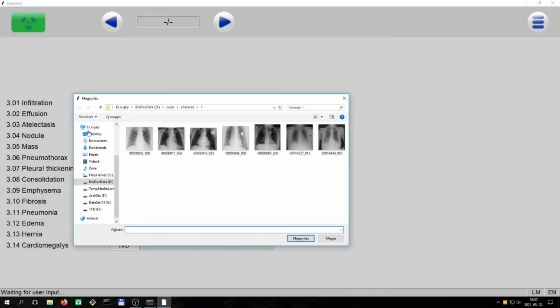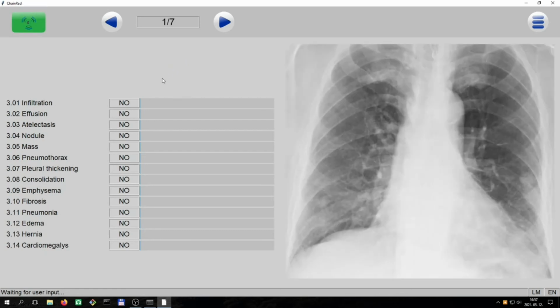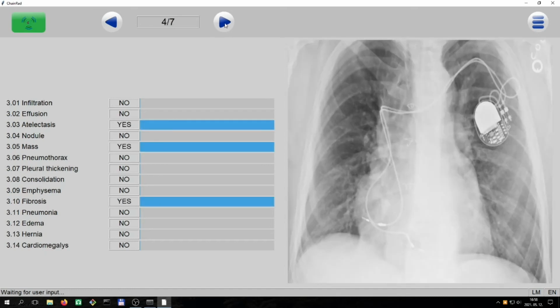The concept of ChainRad is innovative because it uses more pre-trained models and separate classifiers in the same system. Applying transfer learning and training for new diseases was never easier than with our software. In the long term, it is possible to change the whole base model sequence with convolutional networks trained on only healthcare-related images. That's why our software meets the requirements of tomorrow as well.